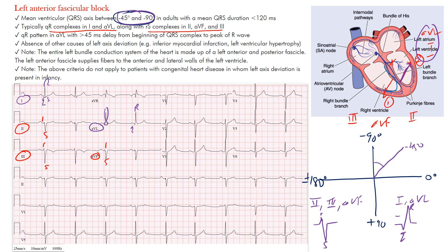The qR pattern in aVL may have a 45-millisecond delay from the beginning of the qR complex to the peak of the R wave — this is the R wave peak time. So from the beginning of the complex to the peak should be greater than 45 milliseconds. Remember, one small box is 40 milliseconds, so it's just above that. Looking at this example, it certainly meets that criterion.